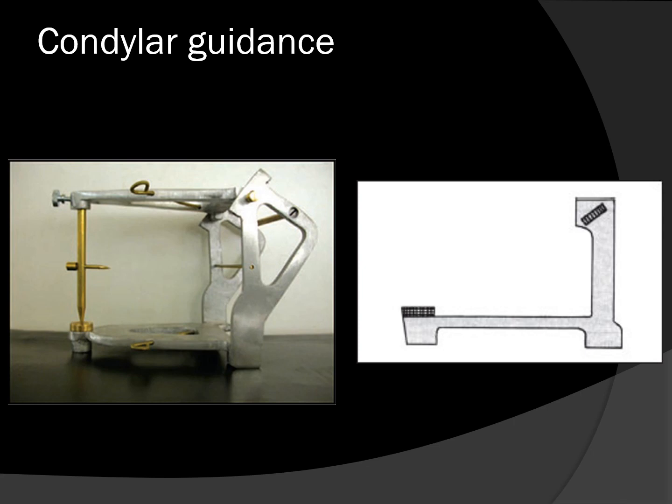Now the condylar element of the upper member passes through this track. You can see here the condylar element passing through this track. And there is also a spring mounted within this track in order to stabilize the condylar element and to hold it in its posterior-most position when no movements are made. So there is a spring present within this slot. This is to stabilize the condylar element in centric relation position, and this condylar guidance does not accept facebow transfer in the mean value articulator.